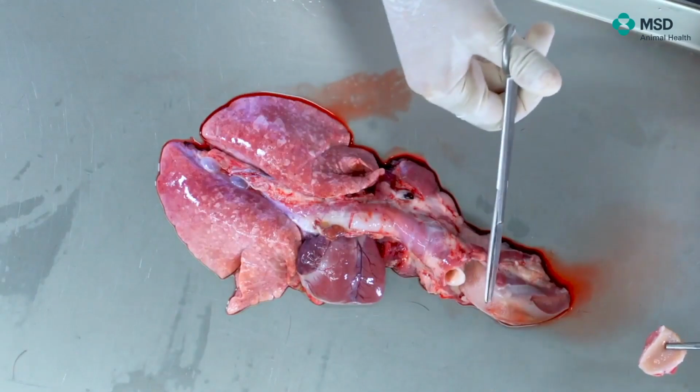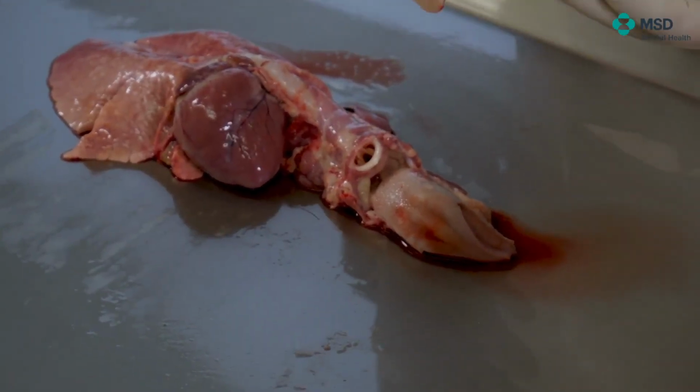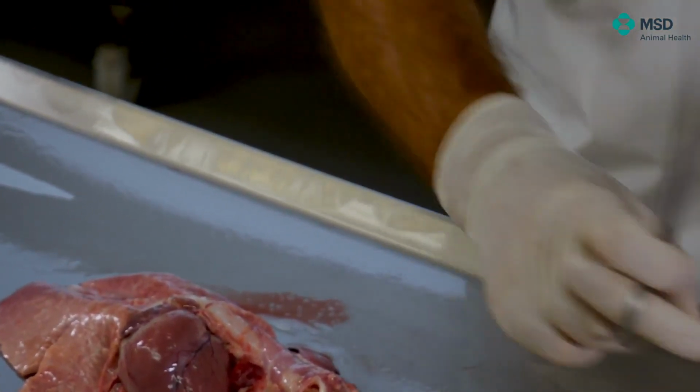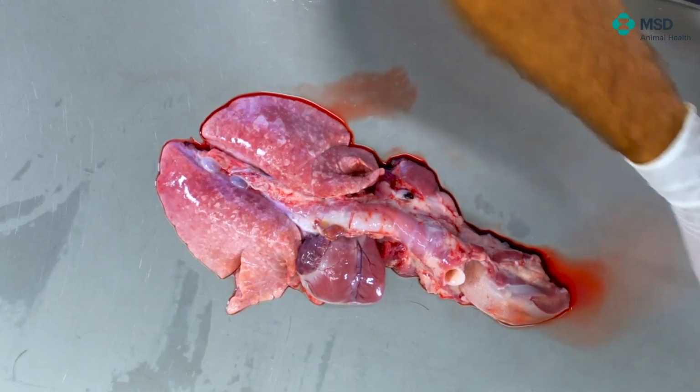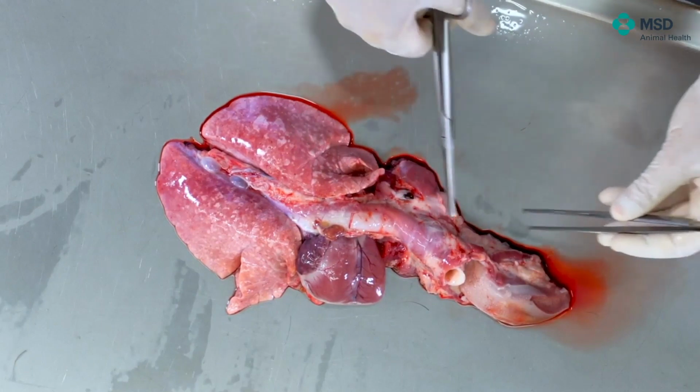So if we are interested in doing PCR sometimes with a small piece, this is a really big piece, but anyway, at the necropsy we can take big pieces and send to the laboratory, and this can be submitted just in refrigeration or even frozen, depends on what you want to do.